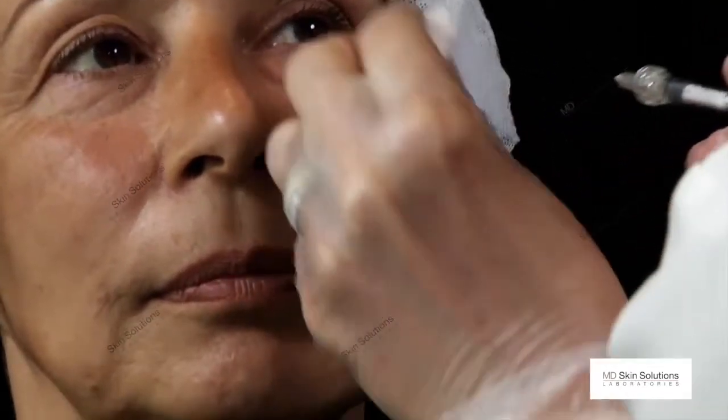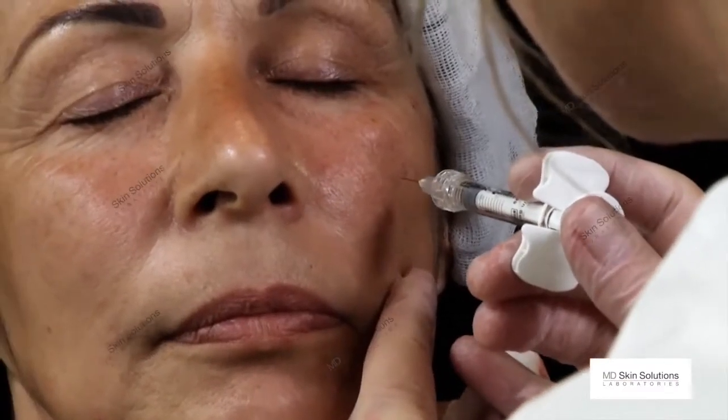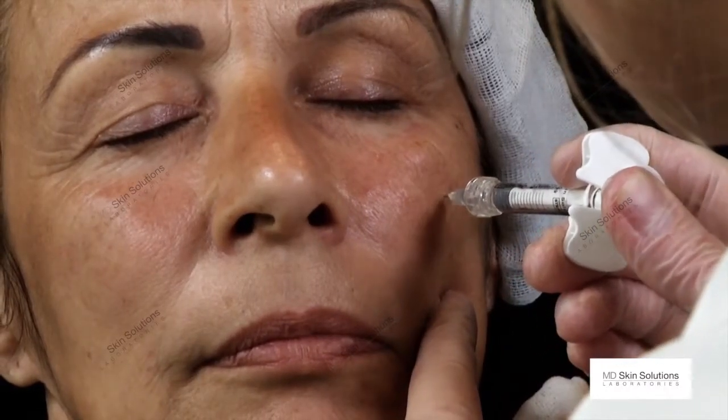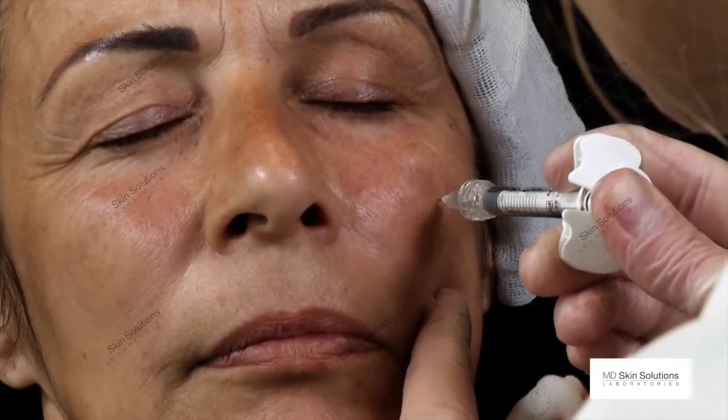The second entry point is the cheek apex point. And I do inject in a bolus-wise way, touch the bone, withdraw the cannula. The second point is in a banana-wise way. Aspirate again, and inject the material here. It's a 0.1 per bolus.